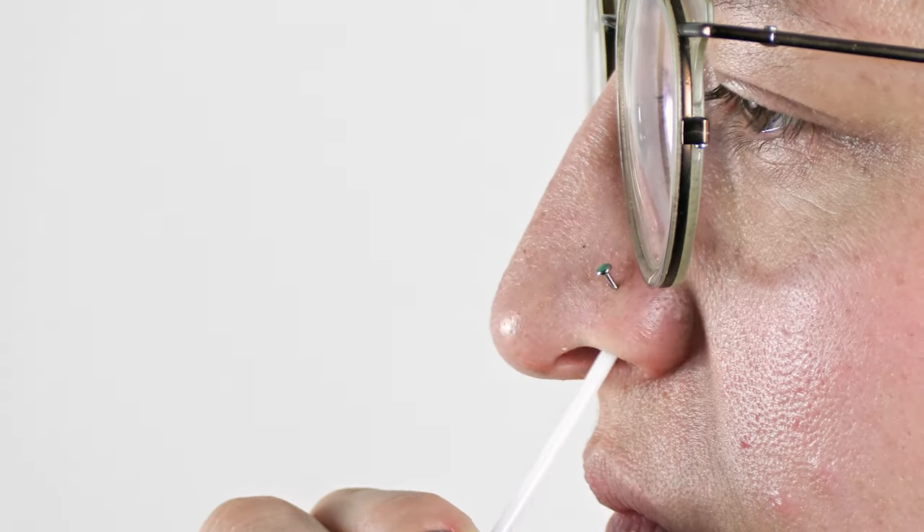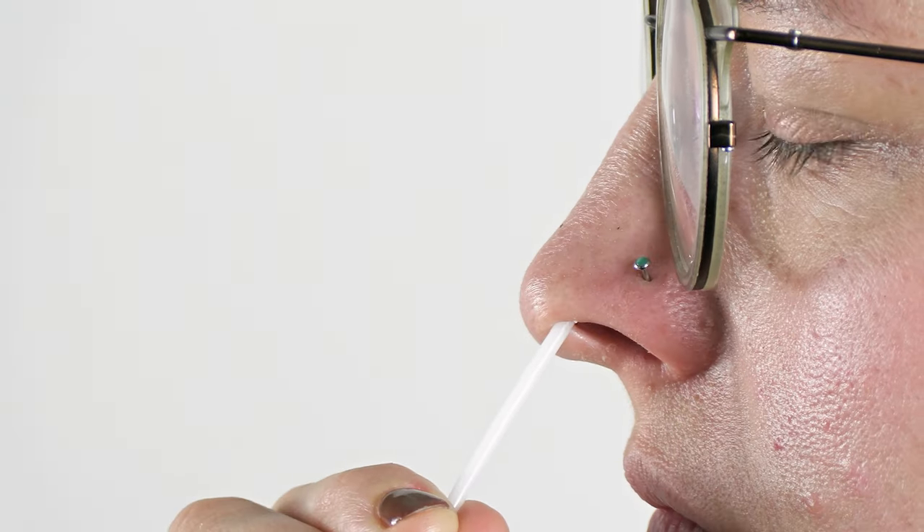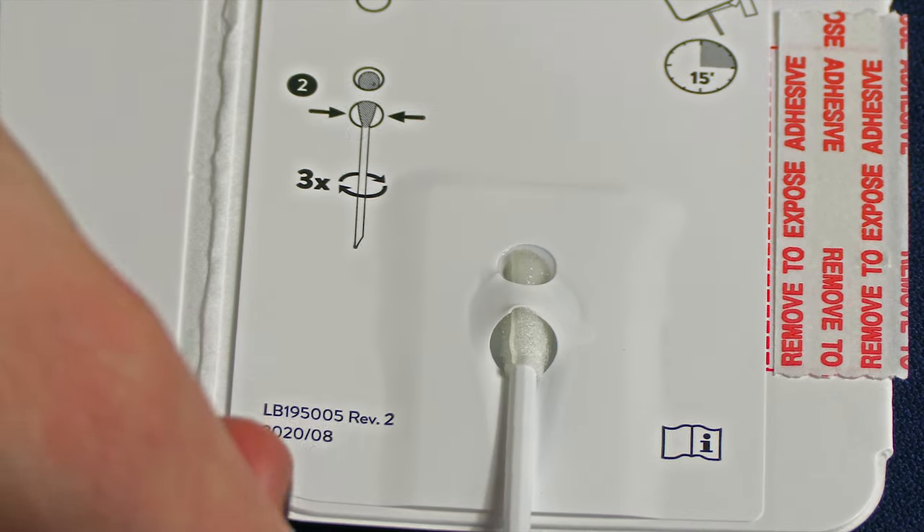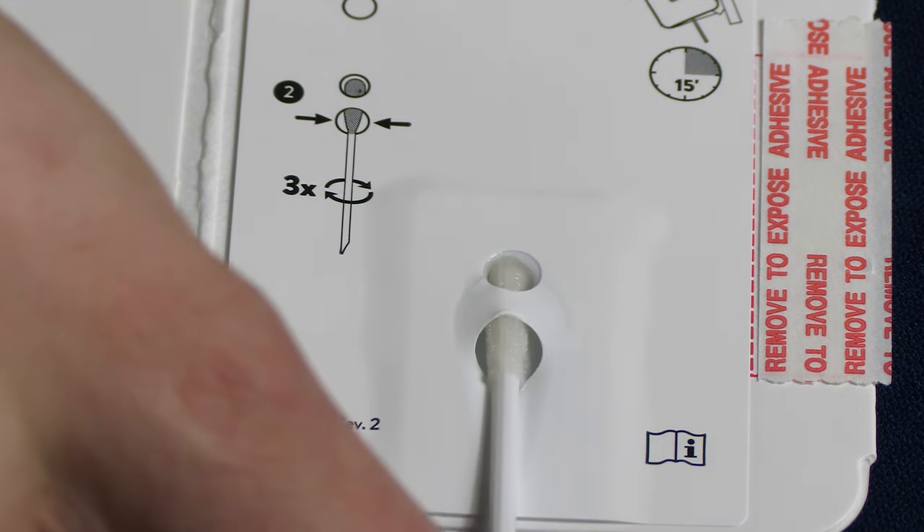Using firm pressure, brush against the inside of your nostril in a circular motion for 15 seconds or five times. Repeat with the other nostril. Insert the swab into the bottom hole and firmly push up until the tip fills the top hole. Rotate three times.